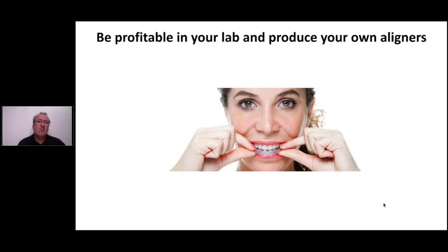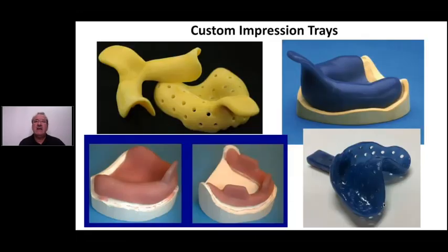Then something else. Many dental labs have to make custom impression trays. Also dentists. Now, I said, if you have to make the custom trays, why not try to make it yourself? Why, as a dentist, do you have to send it to your dental lab? And as a lab, why do you need to have precious technicians making these trays? Why don't you basically design them? And so we developed a software with Sirona, and it was all done in our laboratory.